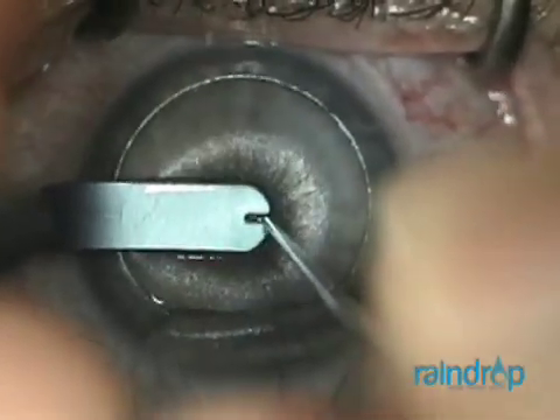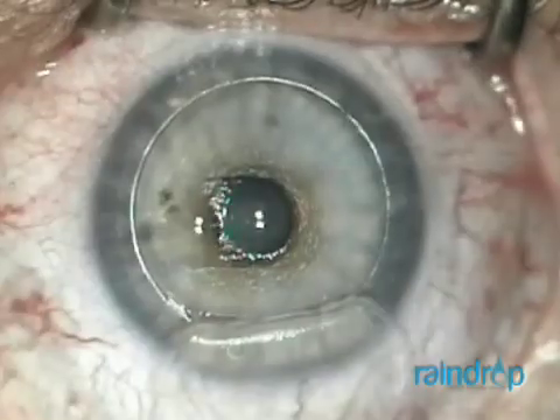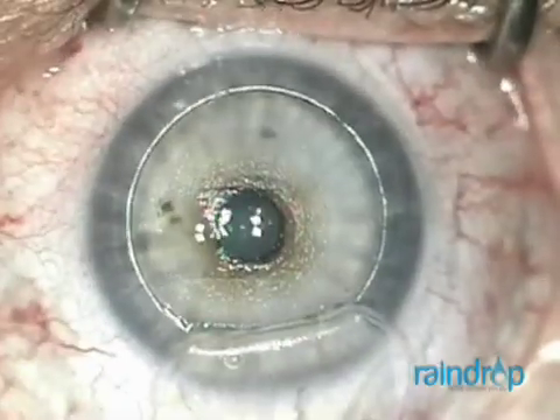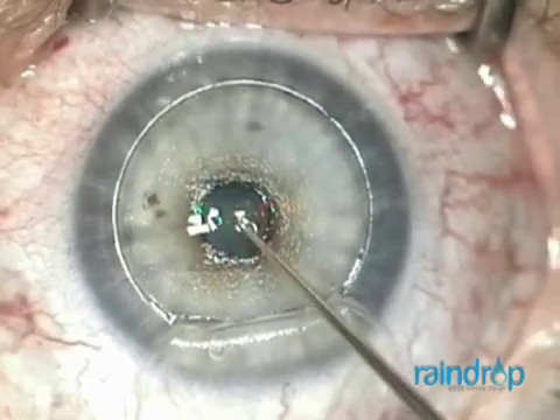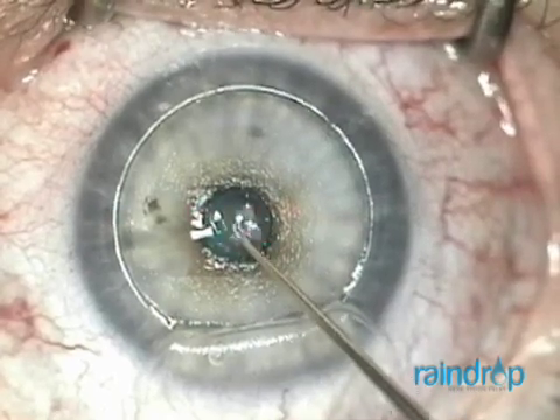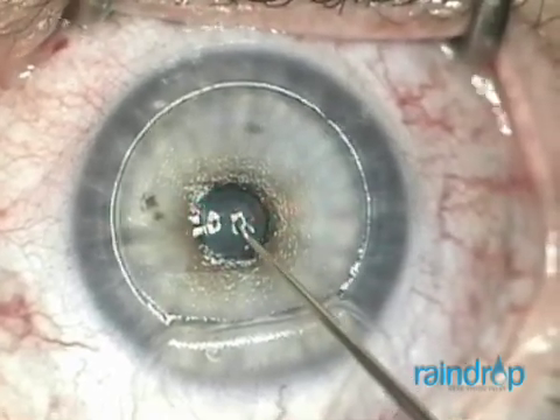I allow the inlay to dry for approximately 60 seconds until it has the appearance of an orange peel or golf ball. In other words, as it dries, it dimples on its surface. Then you know it's fixed in place.